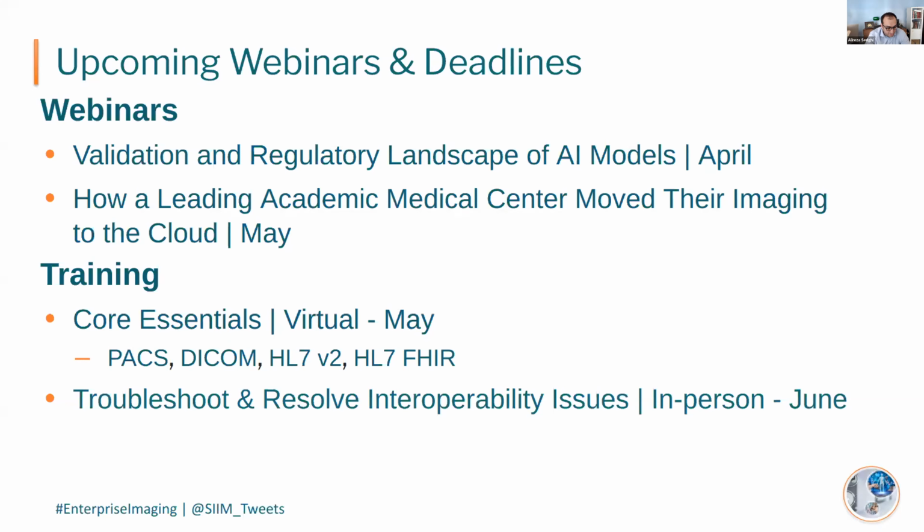All right, great. Great question. So to enhance the community engagement, I guess one of the key decisions we made was introducing the roadmaps. So we published a roadmap, and I can't say how much of a positive effect it had, because people saw that this is a feature that we have not planned, or we have planned, and they can prioritize their list. Also, our roadmap has a section for unfunded features that we would like to have, but we haven't secured funding for it.